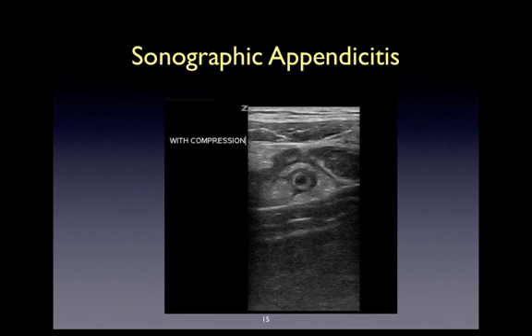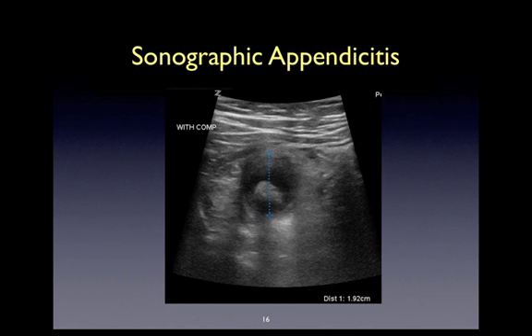Here's another beautiful example of appendicitis. In addition to having a targetoid structure, there's this plump peri-appendiceal fat surrounding the appendix. What the sonographer is also demonstrating here is that even with compression, the appendix doesn't change its shape. This will allow you to identify the appendix and distinguish it from surrounding bowel, which under the effect of pressure will actually collapse upon itself. The appendix, even with pressure applied, will maintain its targetoid structure.